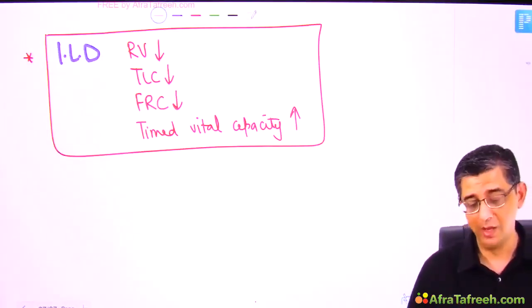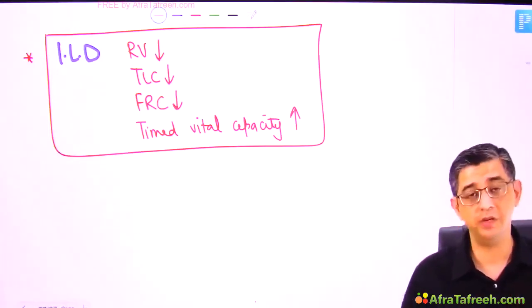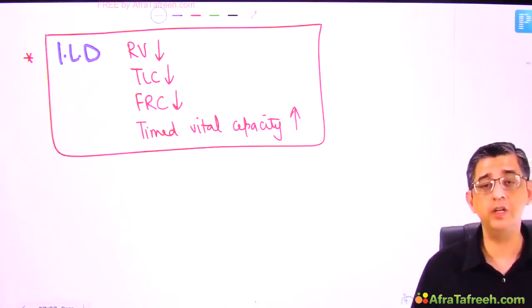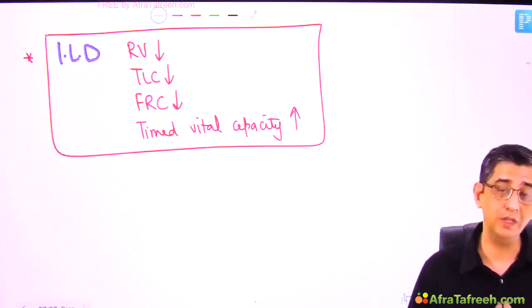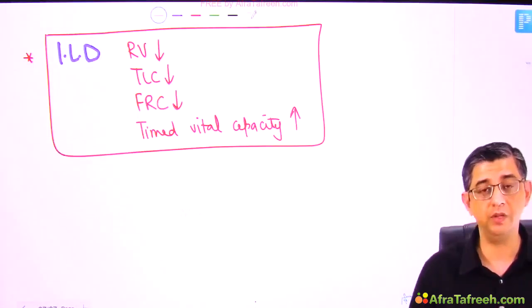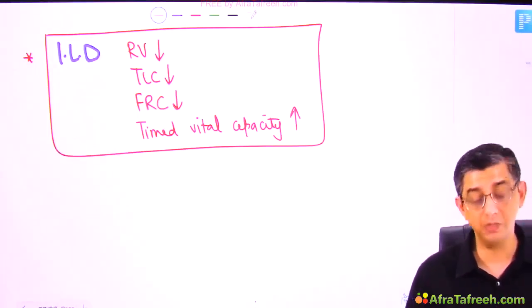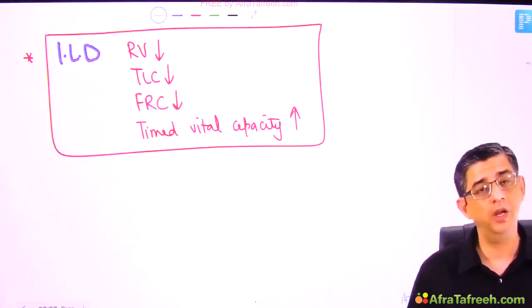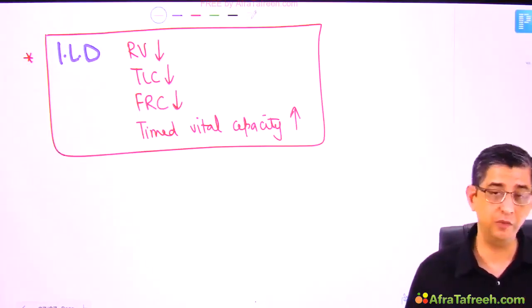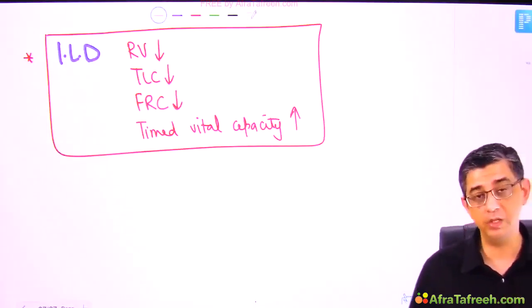That's a separate issue. But the point is, most of these spirometric parameters are very simple and very straightforward. It is just that the orientation of these and the ability to work out faster is what really matters. So here I would say it's not only about accuracy, it's about speed as well, especially when it comes to questions based on spirometric parameters. And flow volume curves, I have hand drawn them before you. If you can just follow them, then I think you would definitely be able to increase your strike rates.